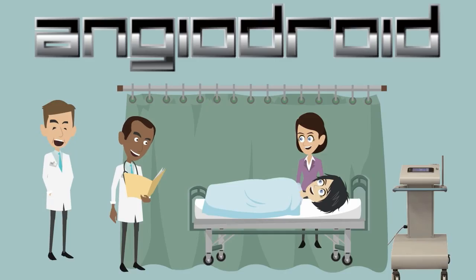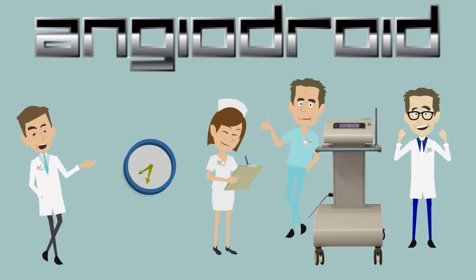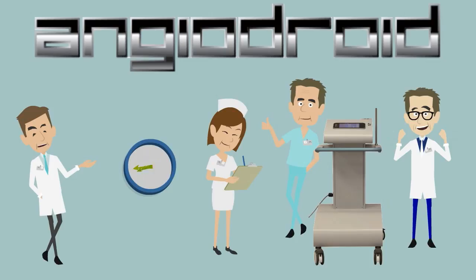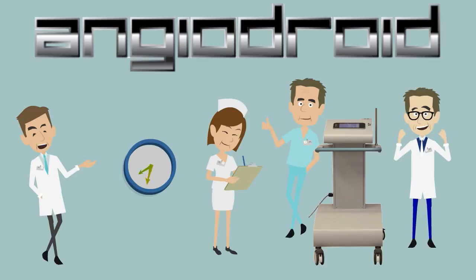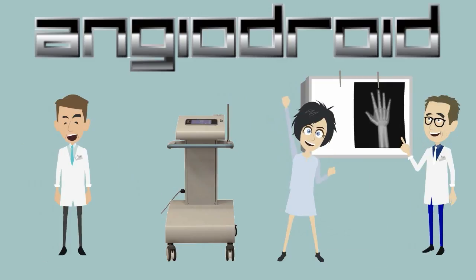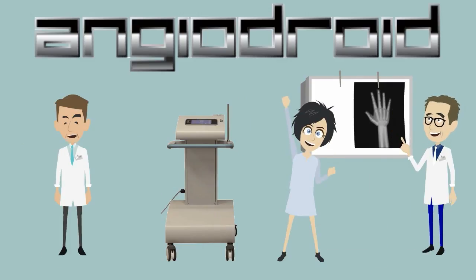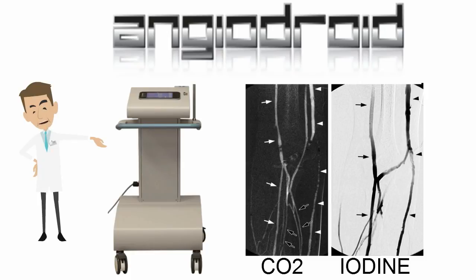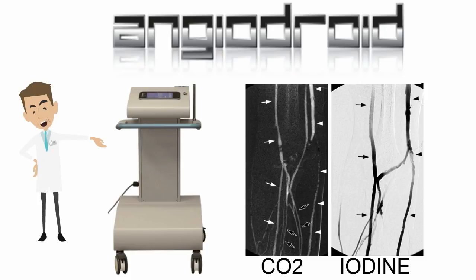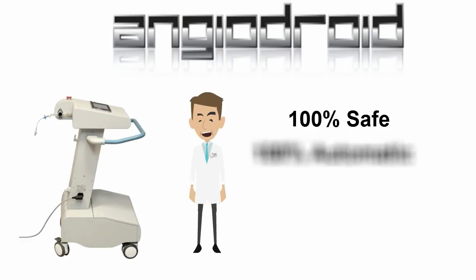Angio Droid ensures maximum safety and comfort to the patient. Its extremely intuitive software ensures high performance during the procedure, reducing the training period for healthcare professionals, who will have more time to diagnose the patient's problem and its solution — especially thanks to an imaging quality comparable to that achieved with iodinated contrast medium.